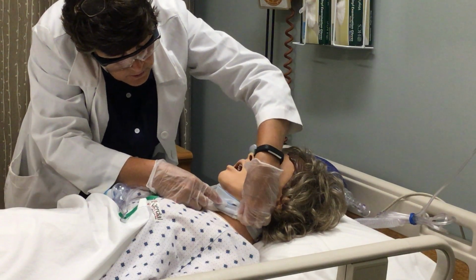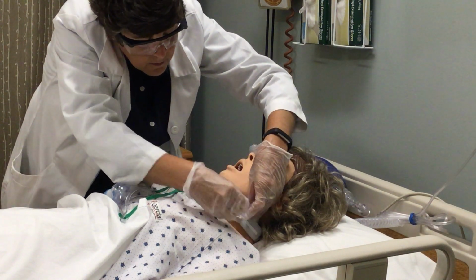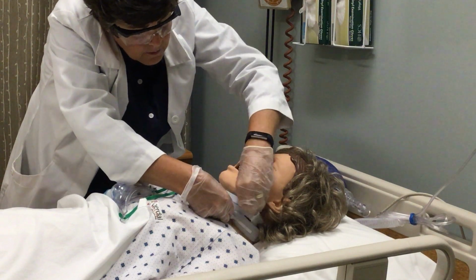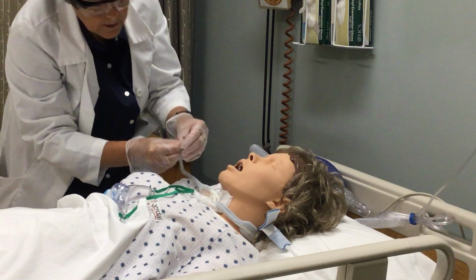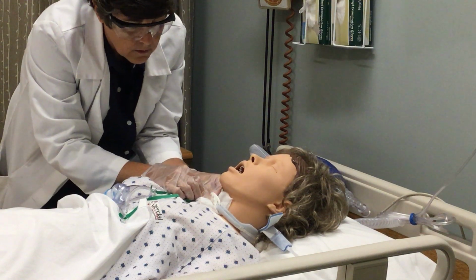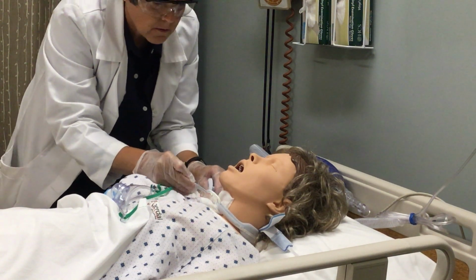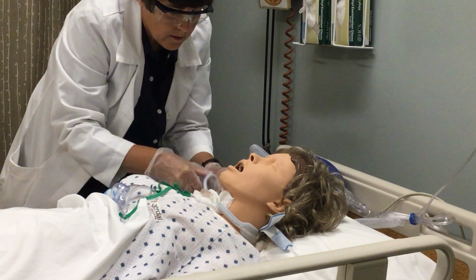Miss Cruiser, we have a lot of Velcro going on here. Put the strand of the last tie up and through, and secure that.